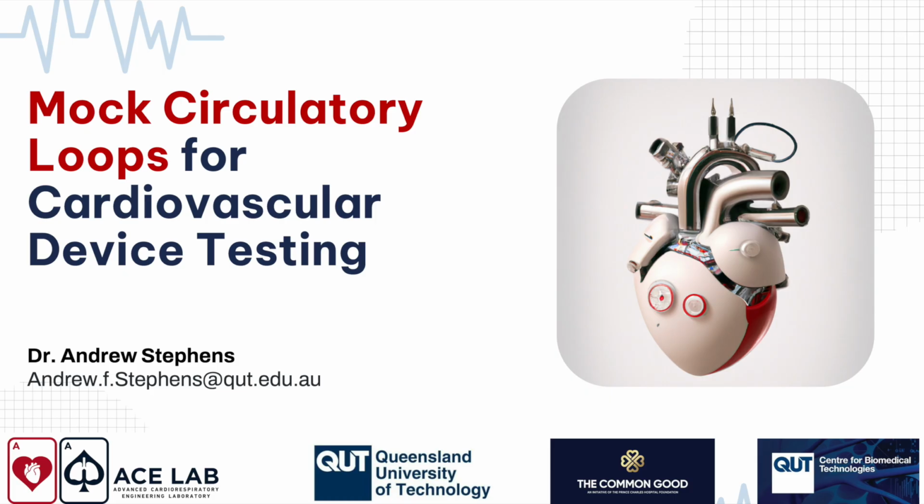Buy extra of everything because it will break, crack, get damaged, blow up, especially in transit if you're going to bring it to the competition. Consider modularity for travel and how you're going to get it through airport security.